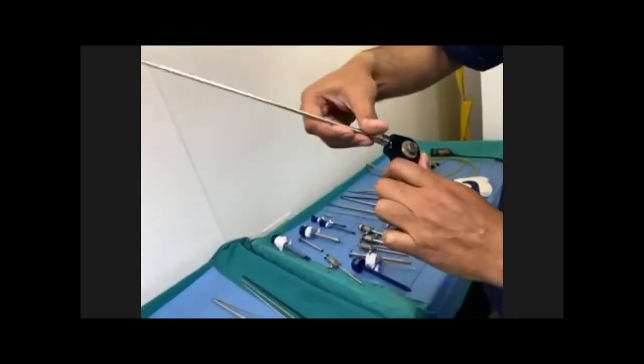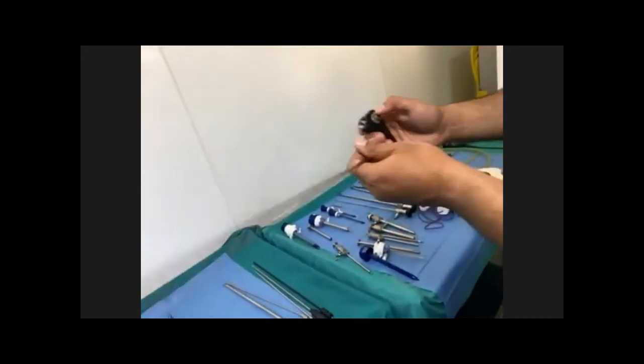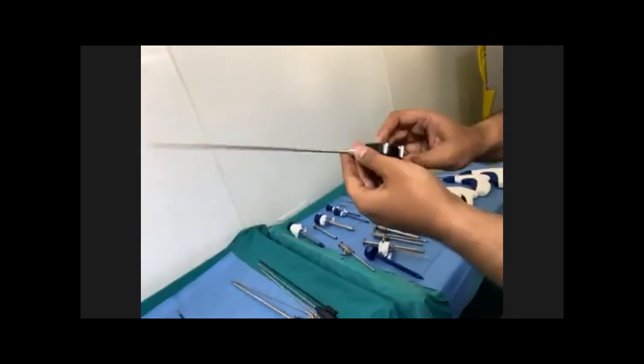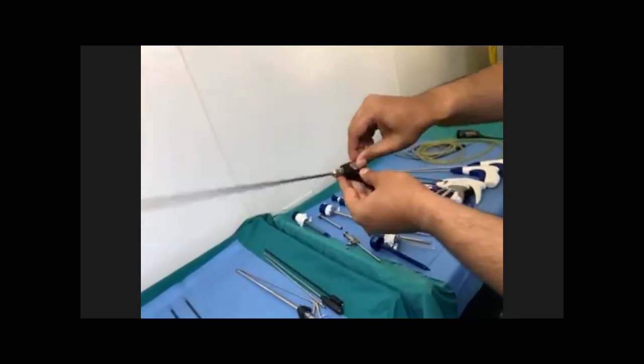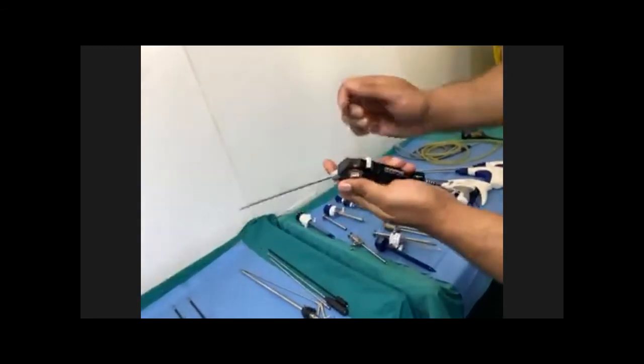And you should be knowing it by yourself more than the technician. Only then, being a surgeon, can you instruct people what to do. So this is another knob. If it doesn't get settled, it just gets opened from here, and you can take this thing out and wash it as well.